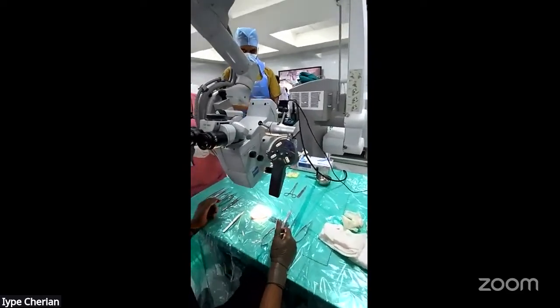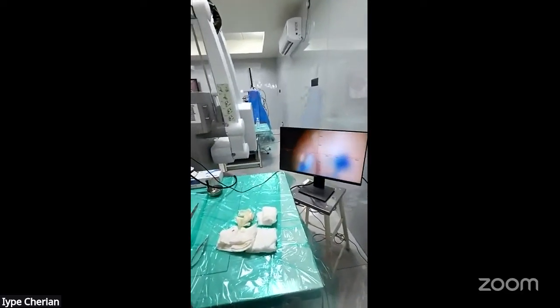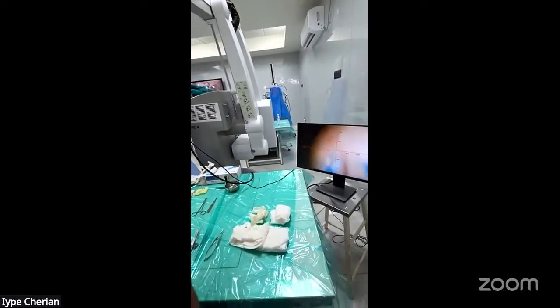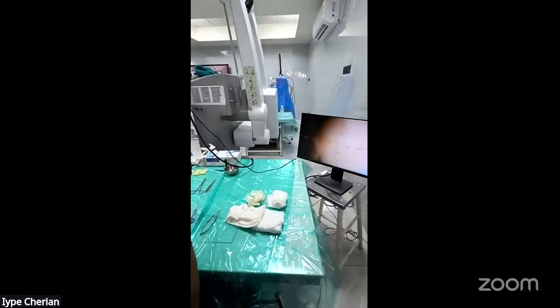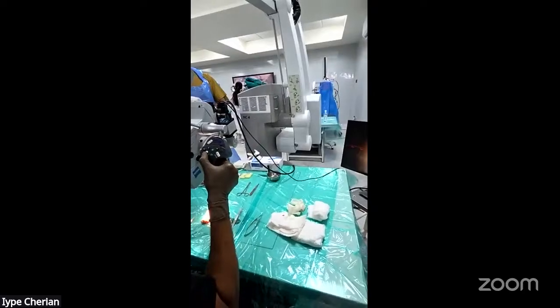So now it is out of my field completely. The camera is somewhere out there. I only need to center it. Actually, the eyepiece and camera are not properly aligned. That is the problem.